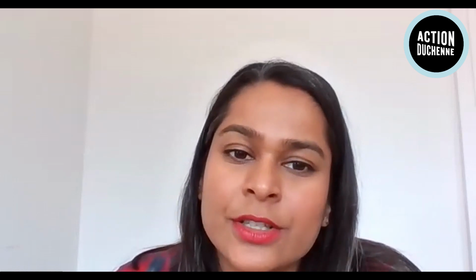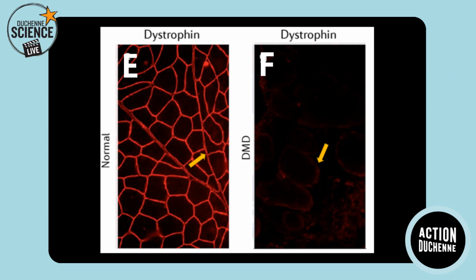So if we just move on and look at what other things a histologist will look at when they have a muscle biopsy cross-section. The next thing that's really one of the most important is the dystrophin distribution. So here we've actually got a muscle, so now we're looking at image E and F.